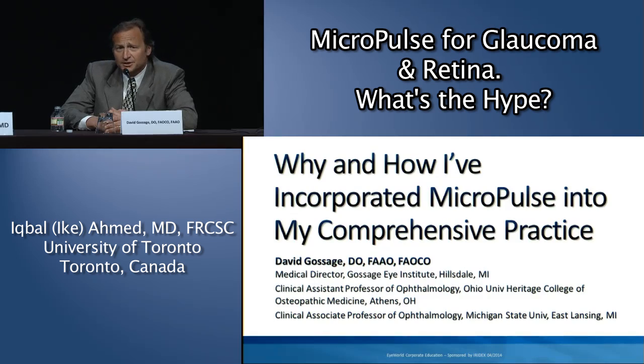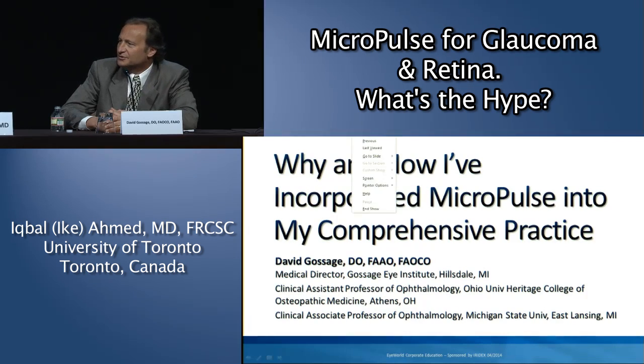Iridex has also developed a lens for those people who are just starting off using this laser. It's a little bit more difficult because you don't see a reaction within the trabecular meshwork, so it's sometimes a little bit difficult to know where you've treated. I think Oculus and Iridex together have created a lens that allows you to flip a mirror around for 360 degrees and basically apply, say, 10 spots per clock hour. And so you get about 120 continuous spots throughout the trabecular meshwork.